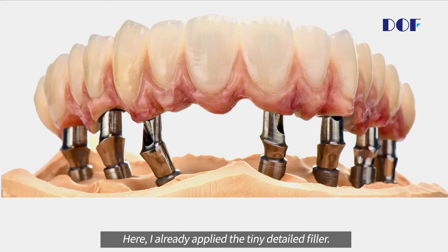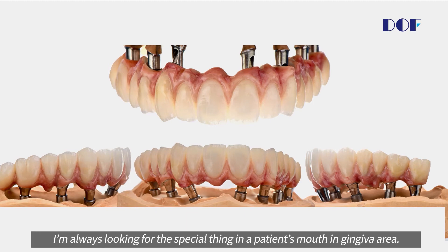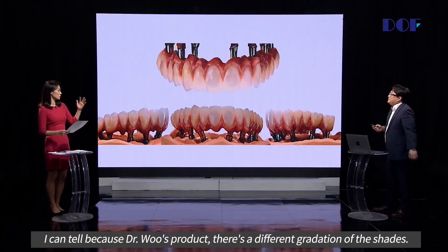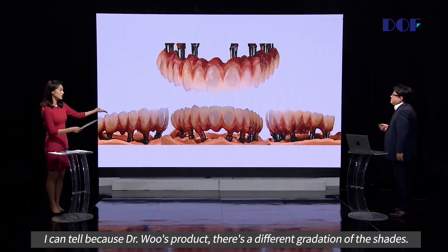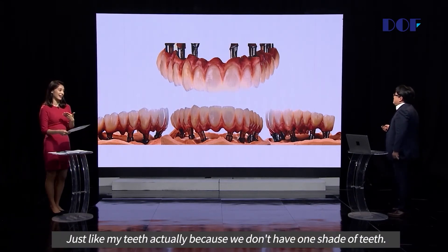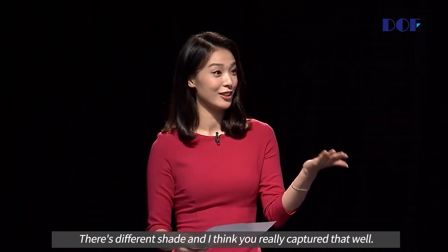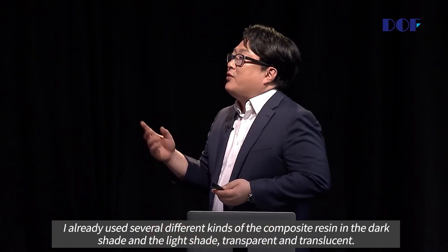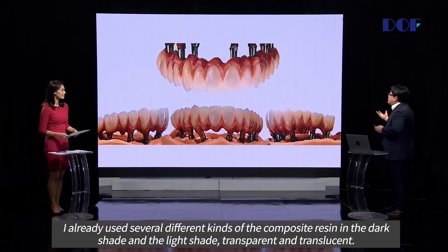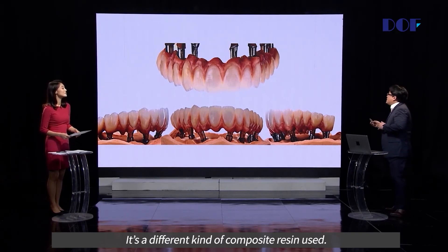I've already applied the tiny, detailed filler — I'm imitating the natural gingival. I'm always looking for the special characteristics in the patient's mouth in the gingival area. There's a different gradation of shades — lighter shades on top and darker shades, just like natural teeth, because we don't have one shade of teeth. I've used several different kinds of composite resin in dark shade and light shade, transparent and translucent — different kinds of composite resin.